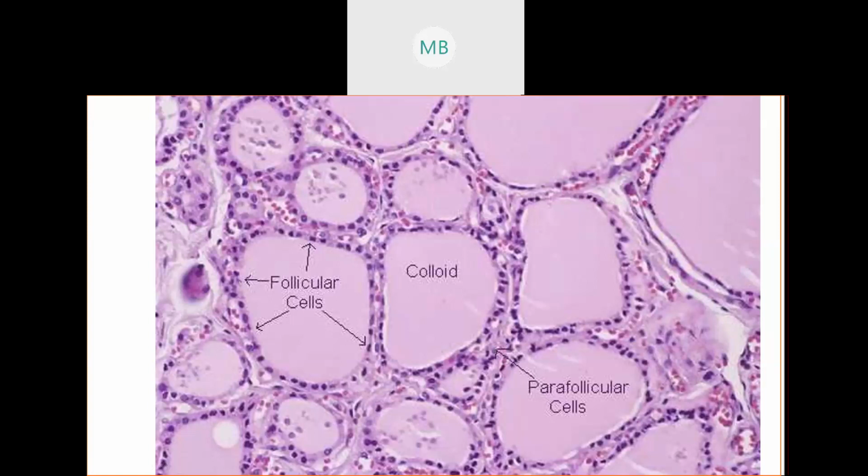That chemical or protein complex is called thyroglobulin. Thyroglobulin is the word that is on your lab list. Your lab manual also refers to this as thyroglobulin. However, if you are reading in your lecture book, the OpenStax chapter, and the PowerPoint for your OpenStax lecture class, instead of referring to it by protein name, the textbook and lecture class refer to this as the collective term for this type of protein, which is colloid.